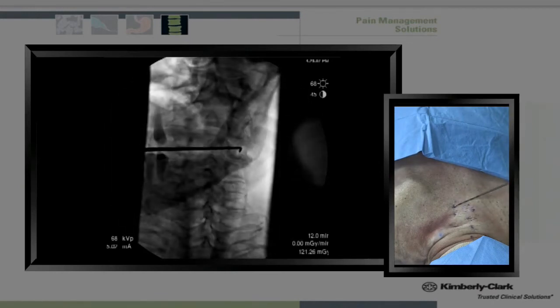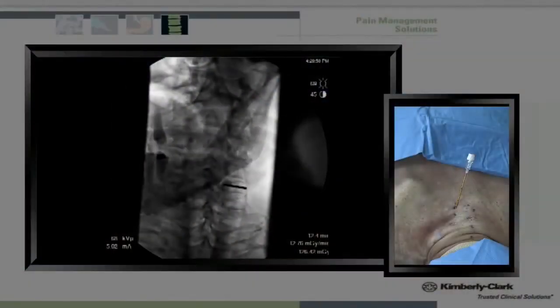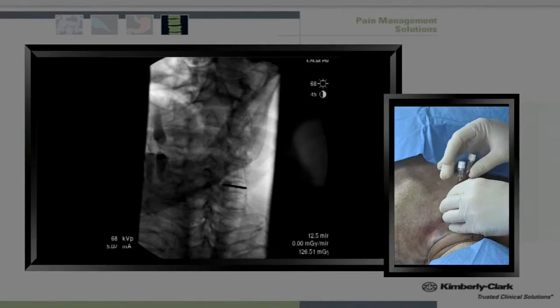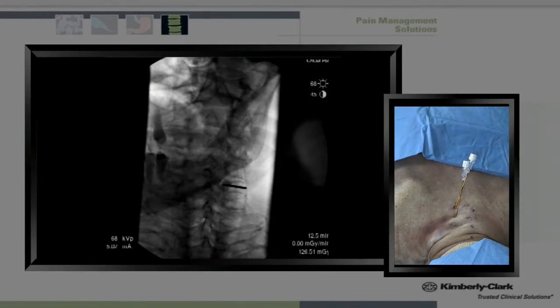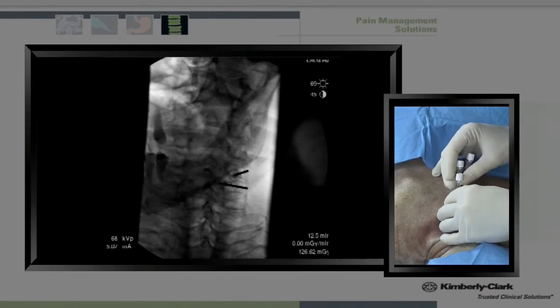I identify the waist with this small indentation of the vertebral body, and anesthetize on the edge of this particular vertebral body. After local anesthetic, I introduce my first needle and slowly guide it down to bony contact. I repeat the procedure after local anesthetic is applied at C5, and then finally repeat again after local anesthetic is applied to C4.